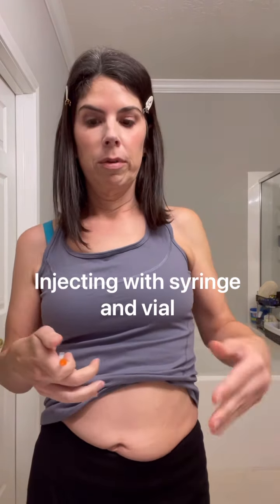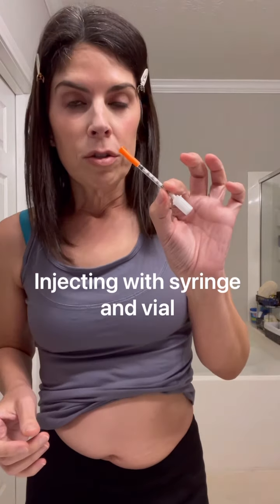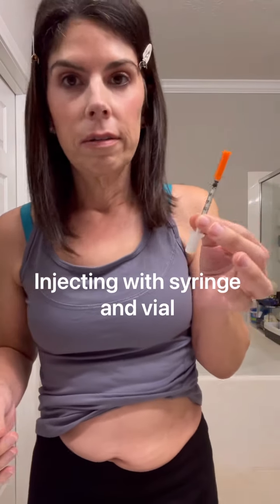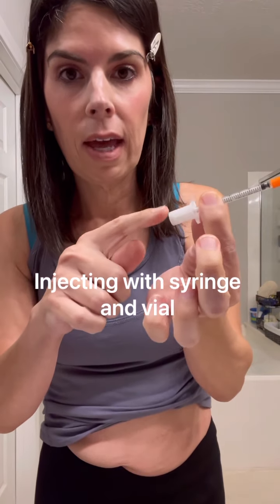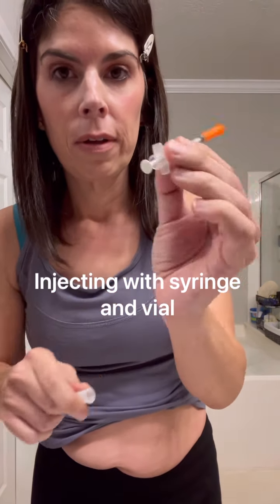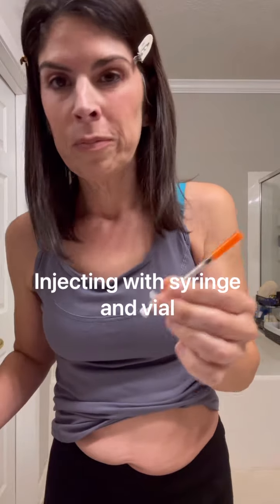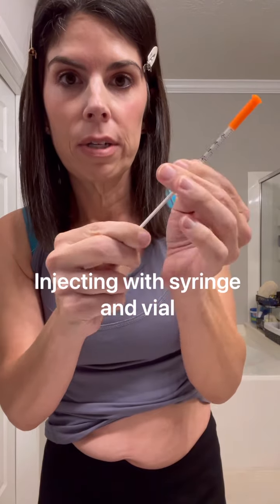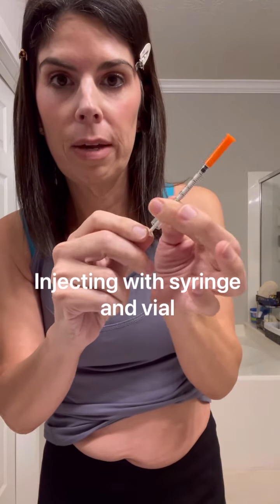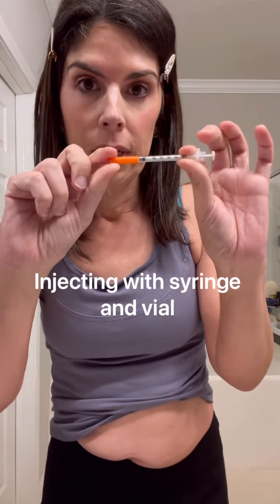Your syringe will come with a cap on the needle and a cap on the plunger. Take the plunger cap off first. Then you want to prime or season the needle — basically just loosen it up by pushing the plunger a couple of times.